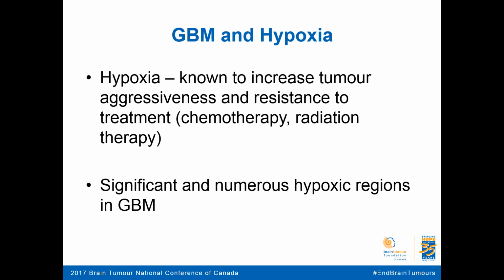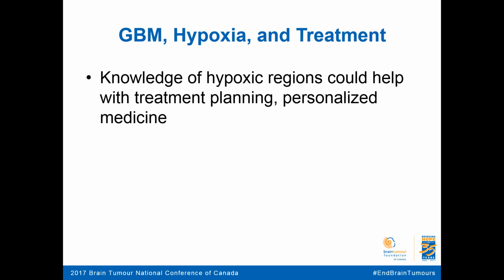If we're doing radiation, and after the end of radiation we can do another oxygenation mapping of the brain, and there are still areas of hypoxia, we can try out a radiation dose boost with SBRT. So we just try to find a way of doing this and measure the numbers. What I wanted was a real number. So we say this part of the brain, the hypoxia is this percent. So this is the oxygenation of that part of the brain.